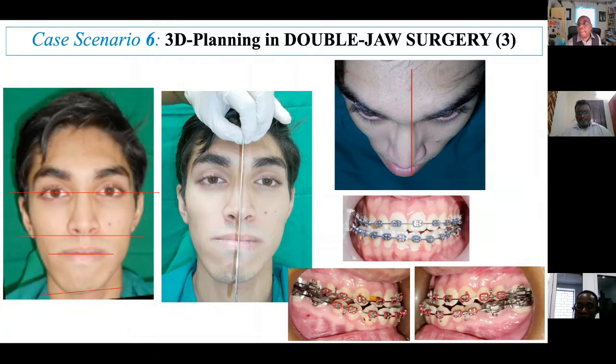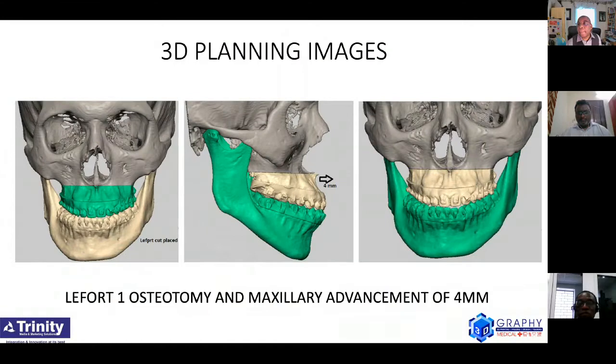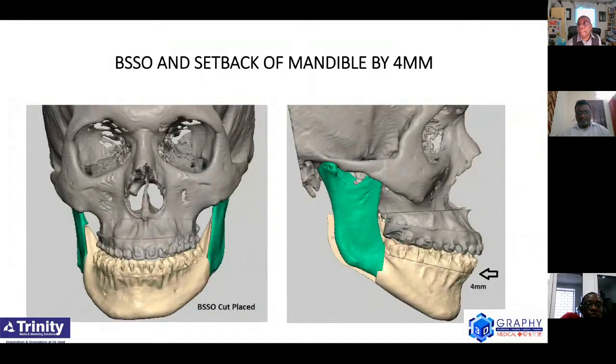These are a few patients who came down from Malaysia. He had a long overgrowth of the lower jaw, subjected to a 3D planning, similar plans taken up, push the maxilla or the upper jaw in the front and a differential movement for the lower jaw. And that's where the mandible goes back.